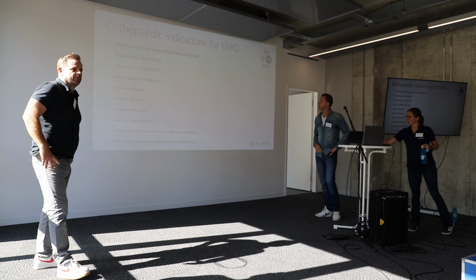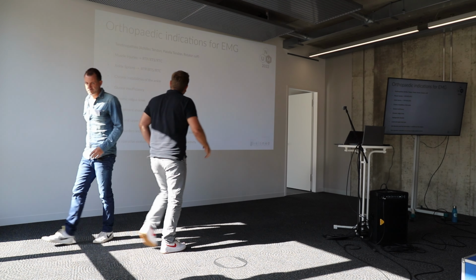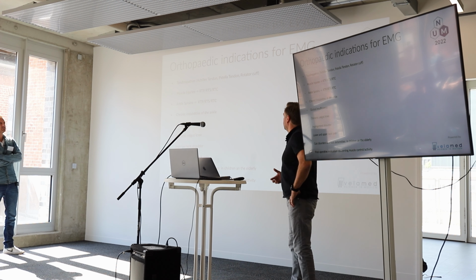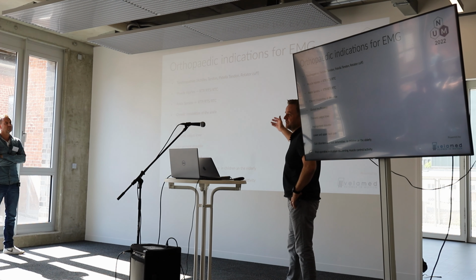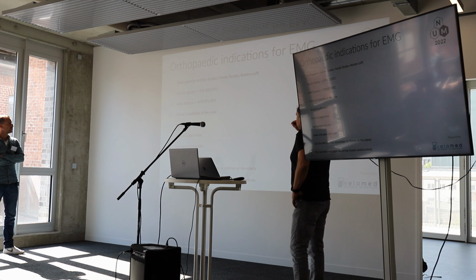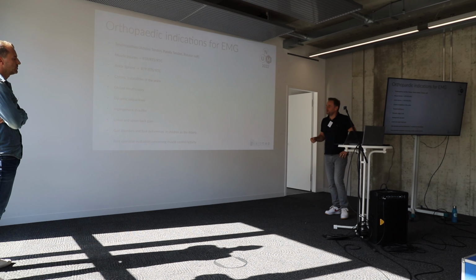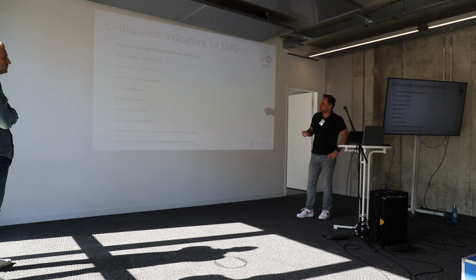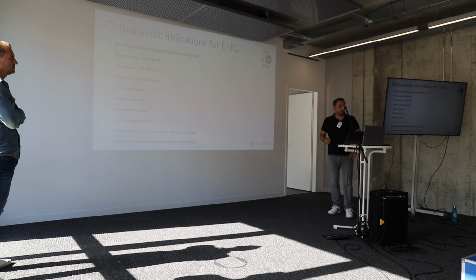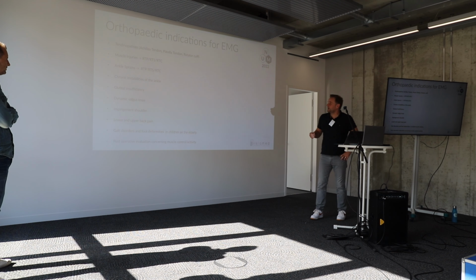We've been doing this for about 3 years now, and we found more and more indications for EMG analysis. Especially tendinopathies: Achilles tendon, patellar tendon, rotator cuff, return to sports, competition, practice, or muscle injuries, ankle sprains, chronic instabilities of the ankle, insufficiency of the glutes, which is very common, especially in athletes, although they look pretty good in shape.